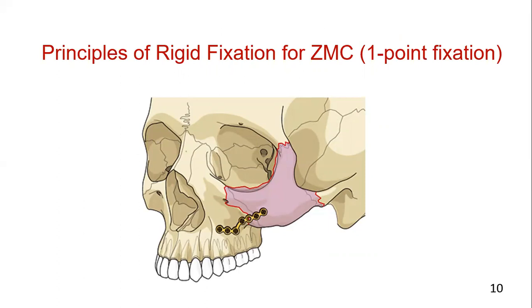Now come to the 1 point of fixation of the zygomatic complex fracture. In some situations, a surgeon may have a simple non-comminuted zygomatic complex fracture. This has often been achieved with the maxillary vestibular approach. This approach allows visualization of both the maxillary buttress area and infraorbital rim, particularly in patients where a CT has revealed no separation at the zygomatic-frontal suture.